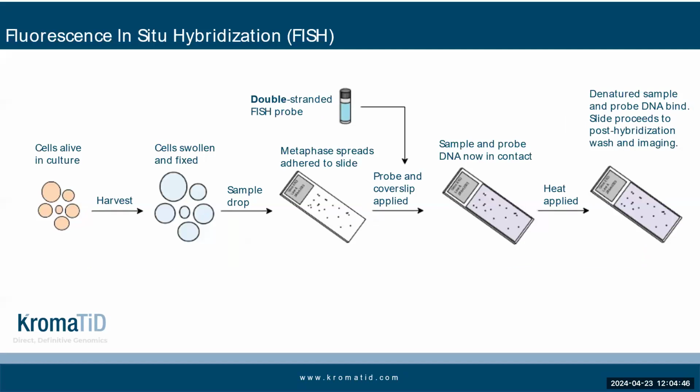Of the techniques discussed, FISH, specifically metaphase FISH, is most similar to DGH and can serve as a starting point. Metaphase FISH begins with live cells in culture. Not long before culture harvest, cells are exposed to a mitotic blocker such as colcemid, which stops dividing cells from progressing past metaphase in the cell cycle. Cells are next dropped onto glass slides, where many of them will lyse, spilling their contents. Controlled ambient conditions cause those lysed cells to form metaphase spreads.